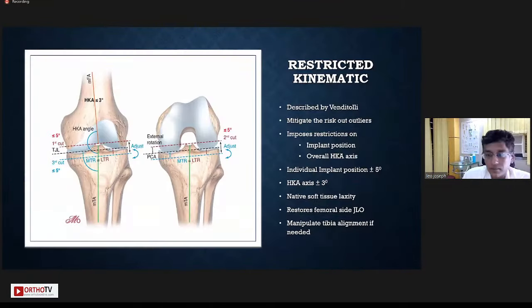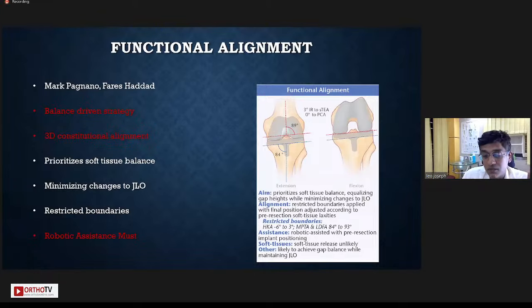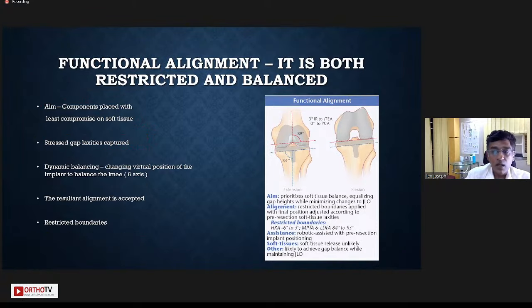Fair enough. But as robotics came, people thought, or at least we thought probably correctly, that we have more accurate tools of cutting. And we know how much we can cut and at what angles we can cut it. And so Mark Pagnano and Fares Haddad came out with a functional alignment concept. It is basically a balance-driven strategy, which is based on 3D constitutional alignment, which prioritizes soft tissue balance. Basically, you stretch out your soft tissues, assess how much of a gap you have, and then you retain that soft tissue gap, and then cut your bones in such a way that you end up having a rectangular flexion and extension gap so that your joint fits in perfectly well in both flexion and in extension. Functional alignment obviously cannot be done without robotic assistance.